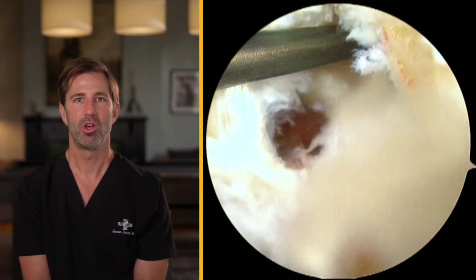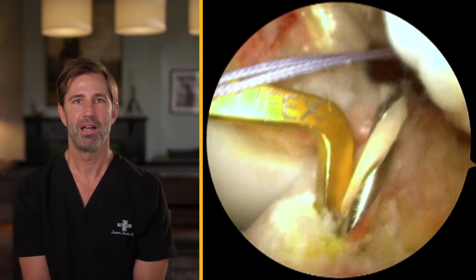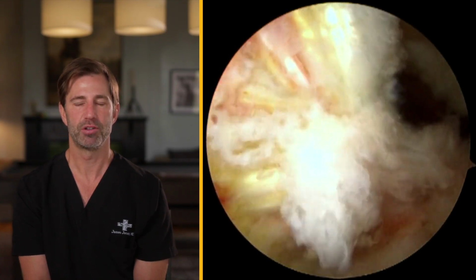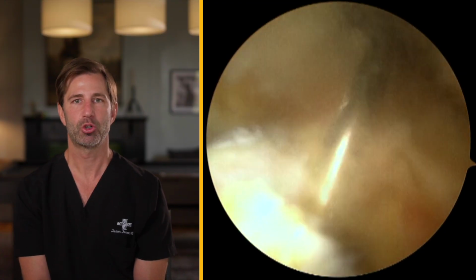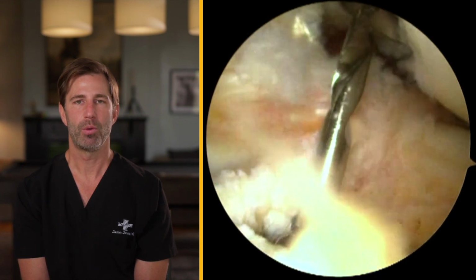At this time, we've used what's called a tibial guide, and we're drilling a pin up into the portion of the knee that will be the starting and origination point for the lower portion of the new ACL. This is inserted into the intercondylar notch. At this point, we ream over this pin to create a 10 millimeter bone tunnel.